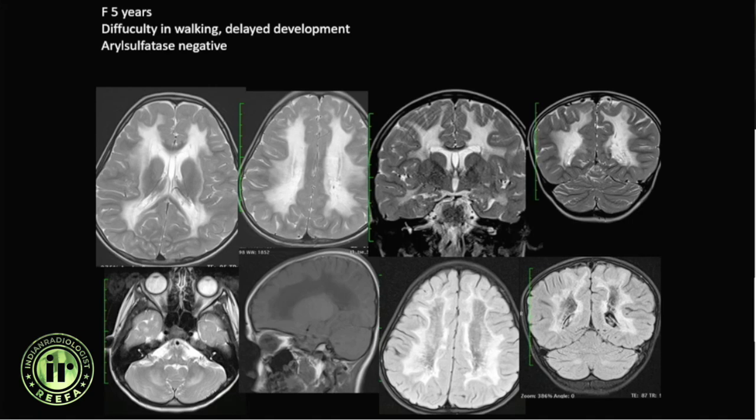The first case is a five-year-old girl with difficulty in walking and delayed development. We first thought it was MLD but arylsulfatase was negative. We are seeing diffuse rarefaction of the white matter on FLAIR images — this was vanishing white matter disease, which was then confirmed.